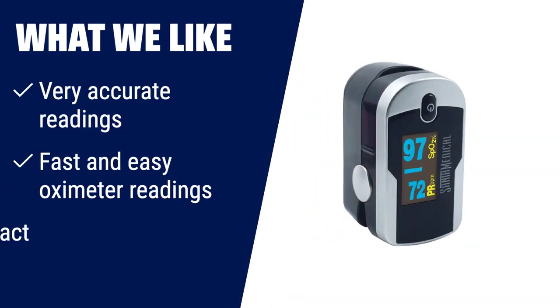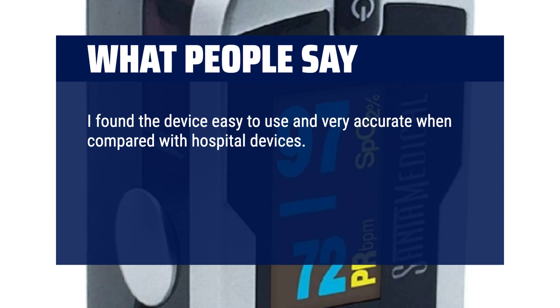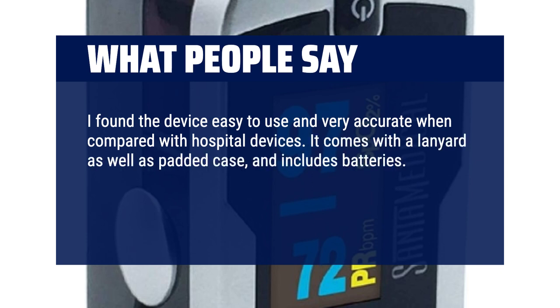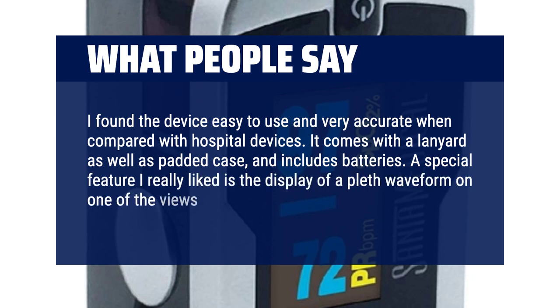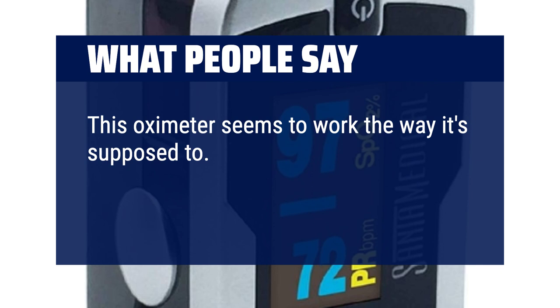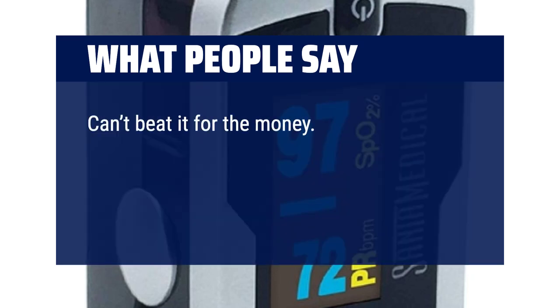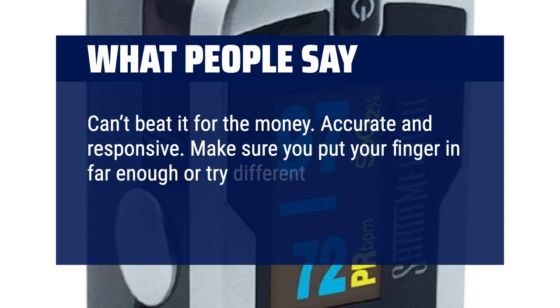What we like: if you're looking for a pulse oximeter that consistently delivers very accurate readings, look no further than the Santa Medical Generation 2 fingertip pulse oximeter. With its fast and easy readings, bright OLED display, and compact design, this pulse oximeter is perfect for home or on-the-go use, accommodating a wide range of finger sizes. What people say: I found the device easy to use and very accurate compared with hospital devices. A special feature I really liked is the display of a pleth waveform, which helps visualize the intensity of each heartbeat. It's lightweight, good value, accurate and responsive.